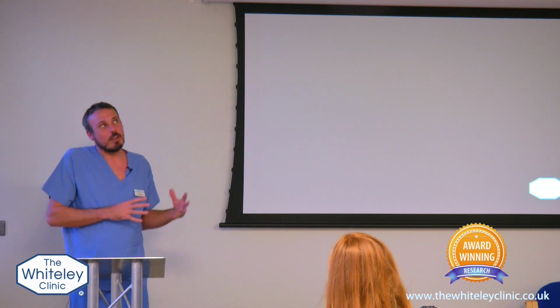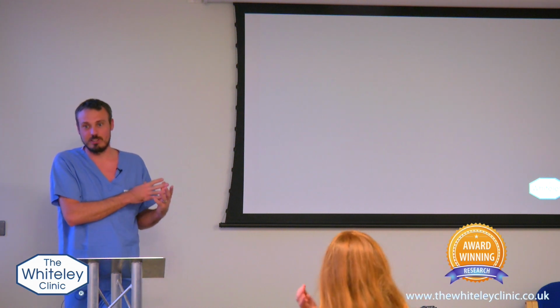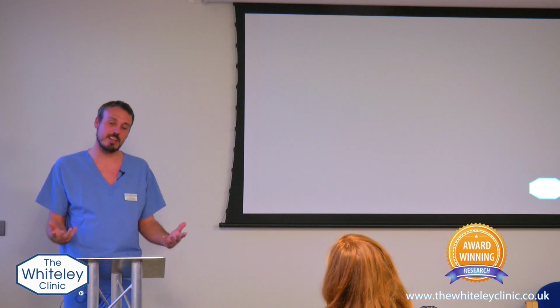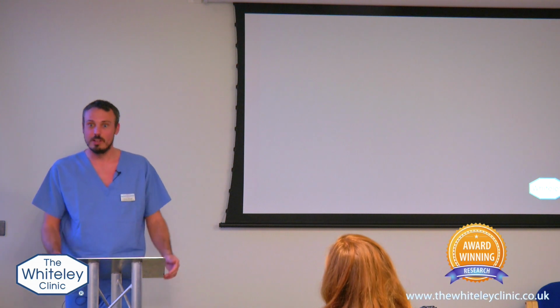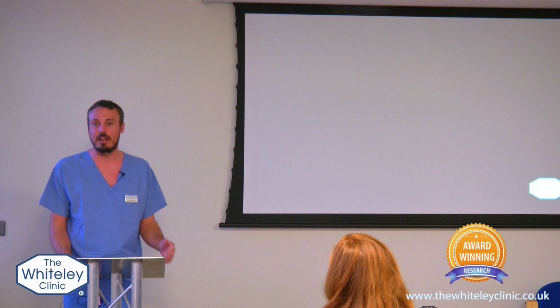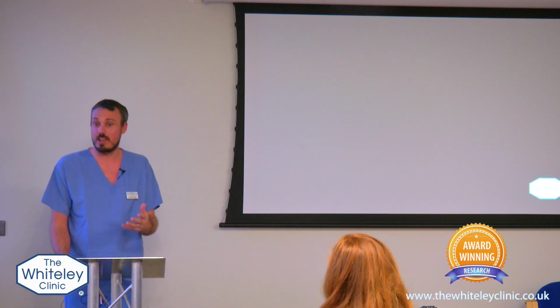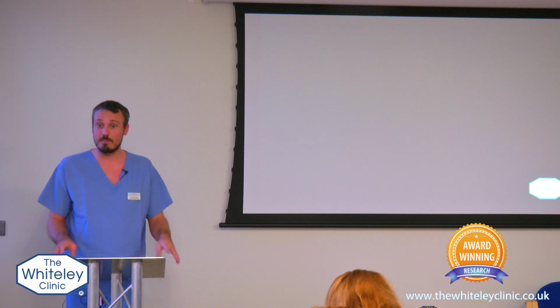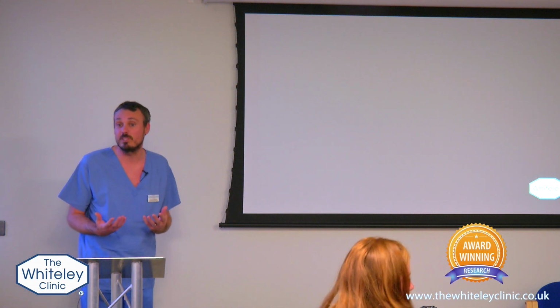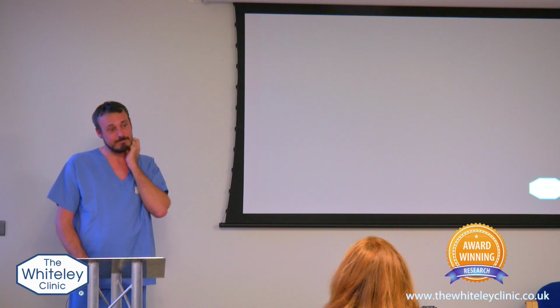To be honest, this is really safe territory. If you're training a registrar, not that we do, but in my NHS practice, if I'm training a registrar to do coil embolization, these are the ideal cases to train people on, because the anatomy is so safe, effectively.